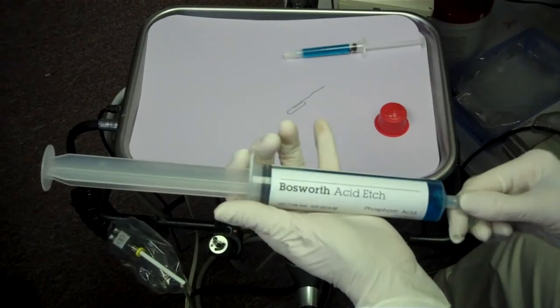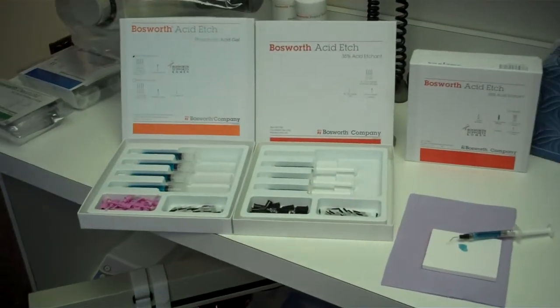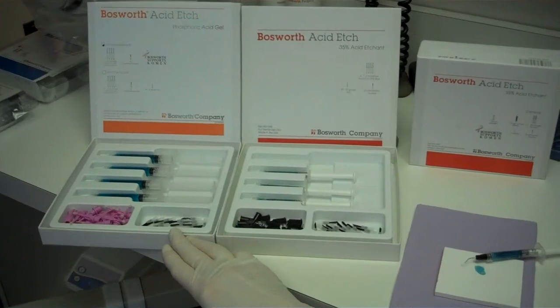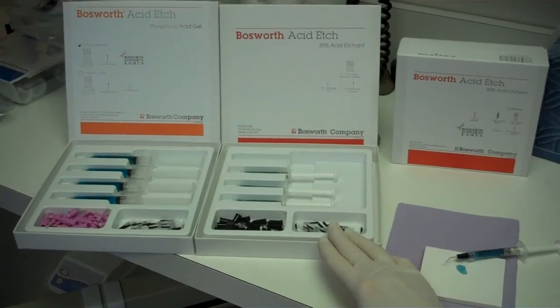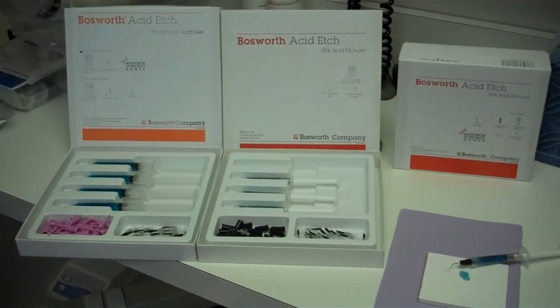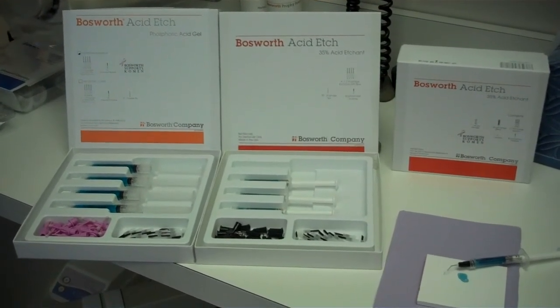Bosworth Acid Etch is additionally available in a 4 × 3 milliliter syringe kit, as well as a 4 × 1.2 milliliter syringe kit. Bosworth 35% Acid Etch is easy to use and economically fulfills all your etching requirements.